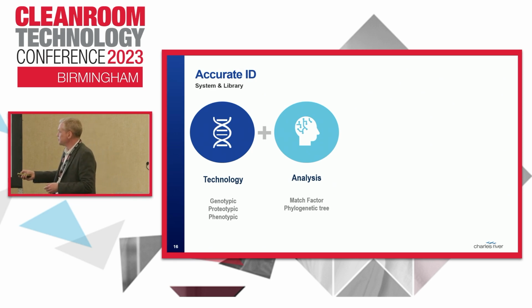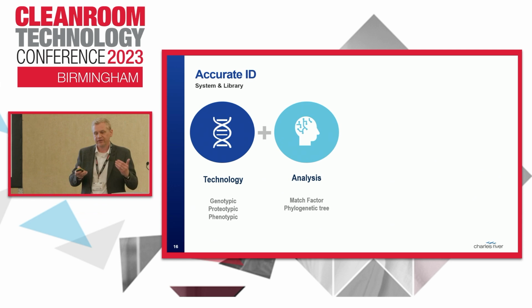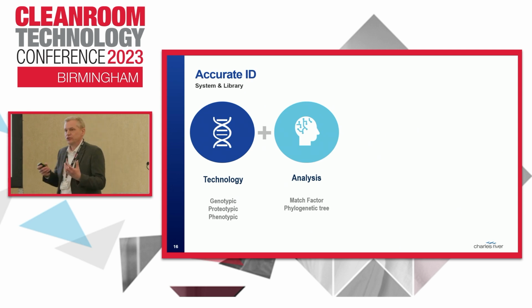For sequencing, I showed you the report we generated, the phylogenetic tree. It's important to be aware of this because you can buy automated sequencers that will give you a comparison to the unknown. It tells you how closely related your unknown is to the library entry, and it will say it's 0% difference, for example, or 0.1% difference, or 1.2% difference.